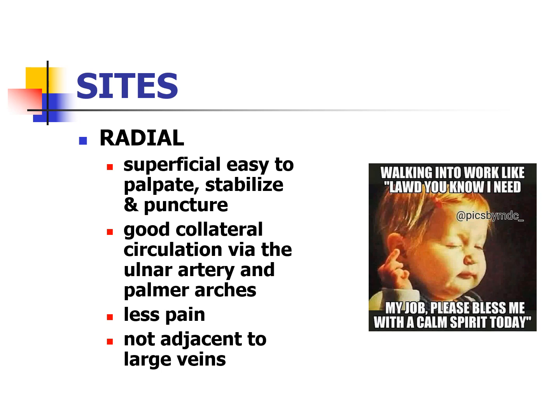So you need to make sure that when you do advance the needle, it's a firm, steady advance. It is not a slow advance. It is a firm, steady advance. Otherwise, you probably won't get it.